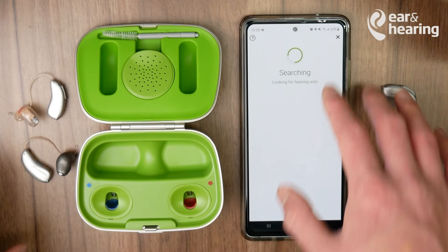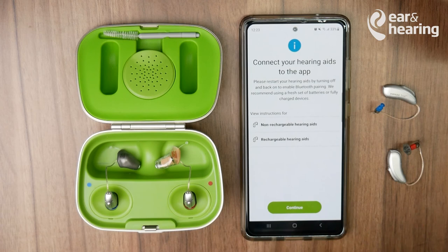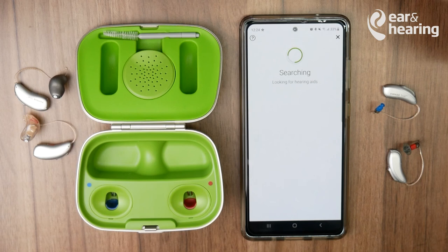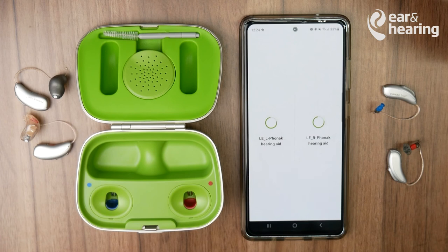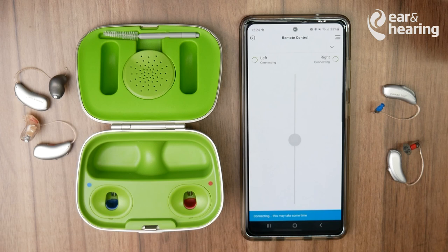This may take a few seconds. If it's still not working, place the hearing aids back inside the charger. You'll see that it's been disconnected — then pull them back out. Go back into the My Phonak app and press Continue. You'll see that the left and right hearing aids are now available — press Select. Always remember: before going into the app, put your hearing aids back in the charger and take them out to reset. They will now connect.